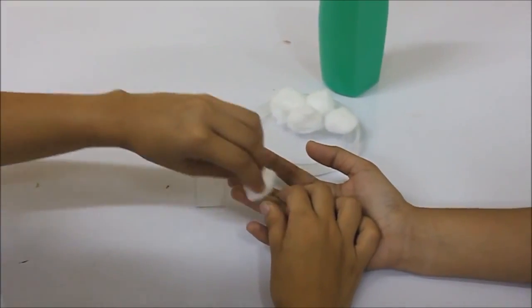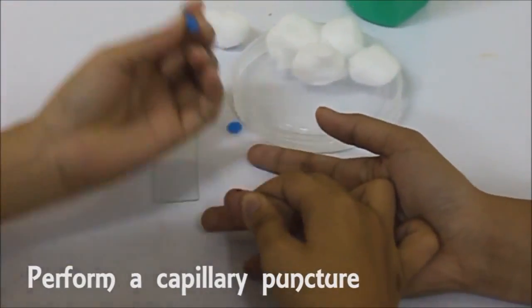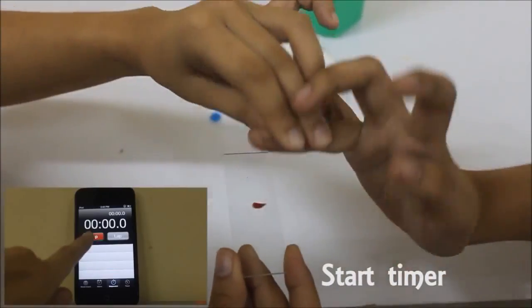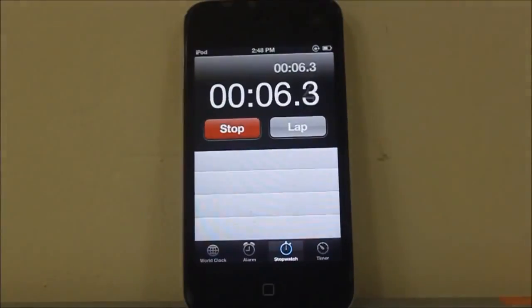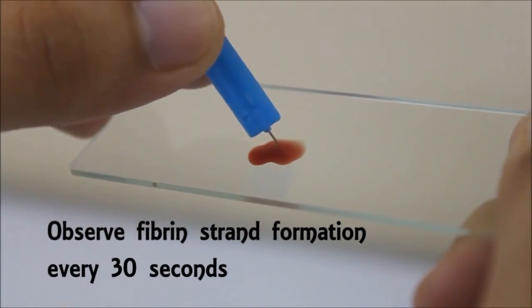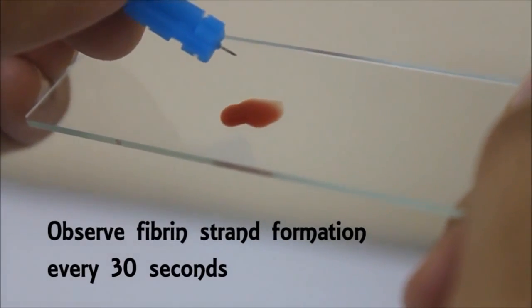To perform the slide method, first, do a capillary puncture. Place a drop of blood at the center of a clean slide and start the timer. At 30 second intervals, let a needle or lancet pass through the blood drop. See to it that you move the needle or lancet upward very gently.